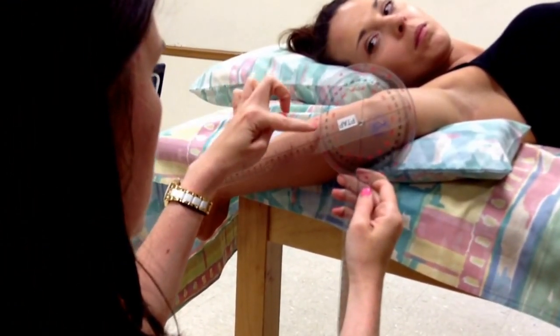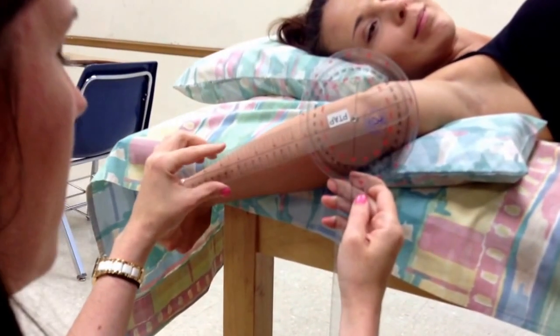She went past 90 — so 100, 110, 112 degrees of external rotation — and we're coming back up to neutral.